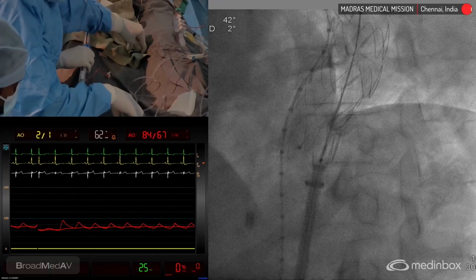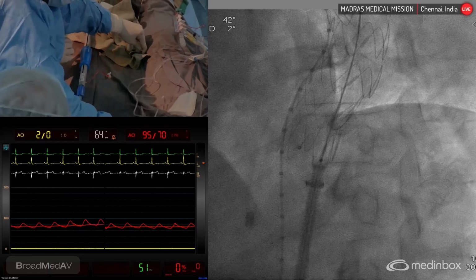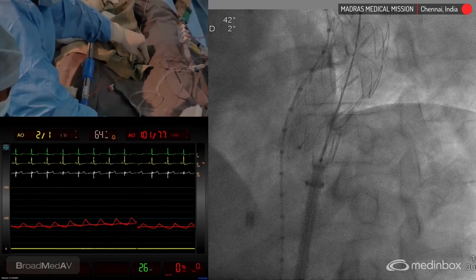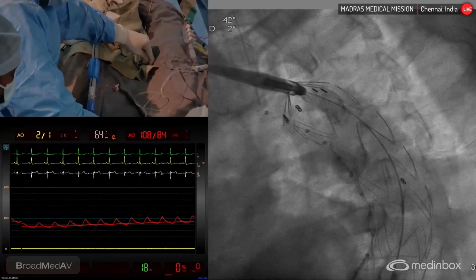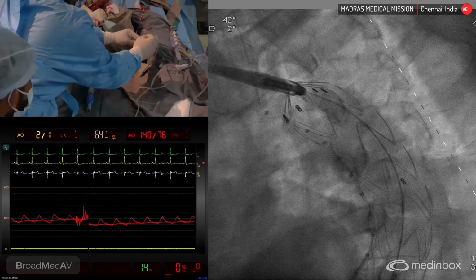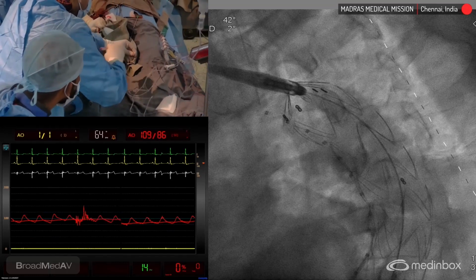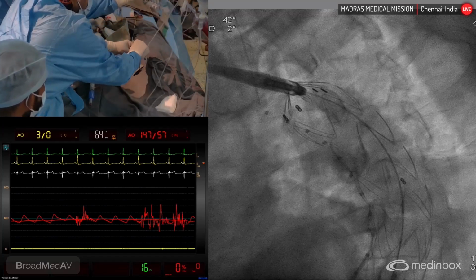So store this and go to the nose cone. We'll remove up here.